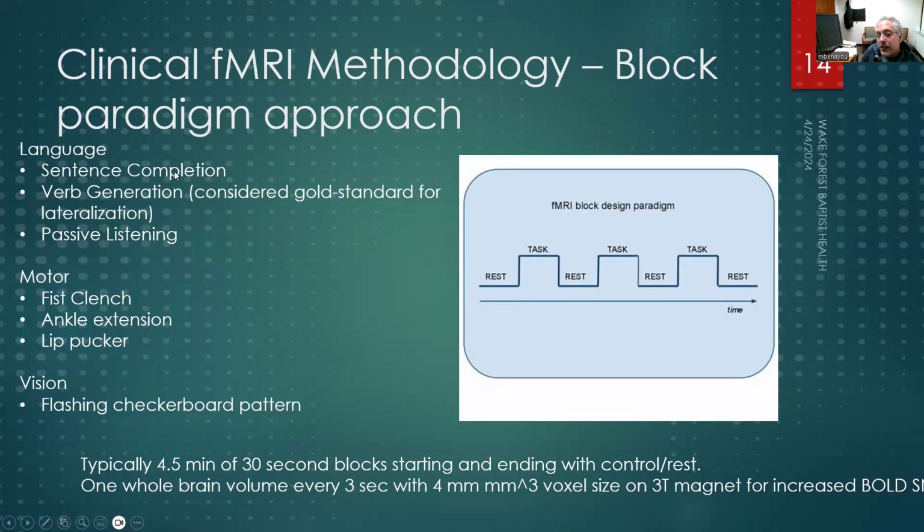So the patient might be looking at a computer screen that has a sentence with a blank. And the context clues of the sentence usually make the blank pretty obvious. So you might see something like, I don't know, I cut up meat for a living. My job is that I am a blank. And maybe you're thinking butcher, I hope. Otherwise, it got really dark really fast. But like a butcher or something, so the context clues tell you what the answer is.